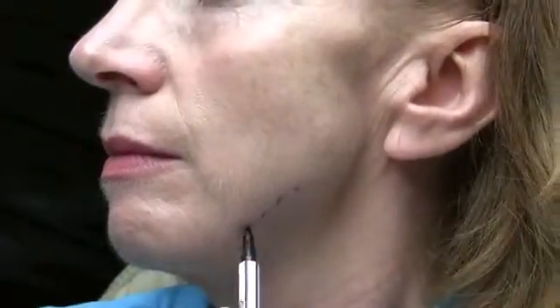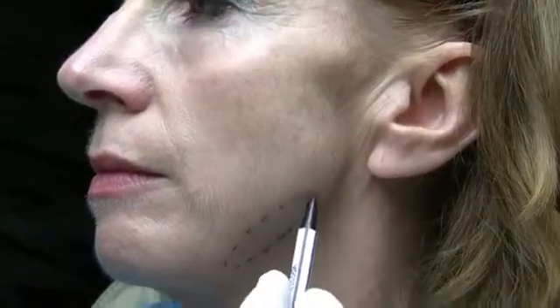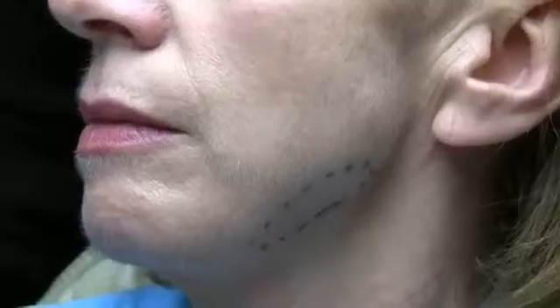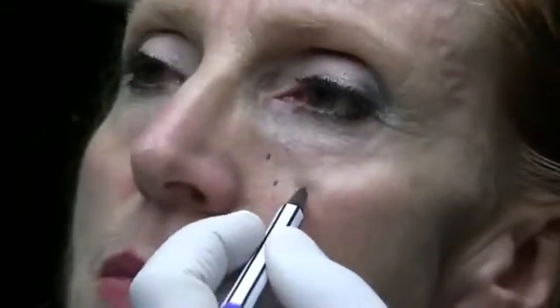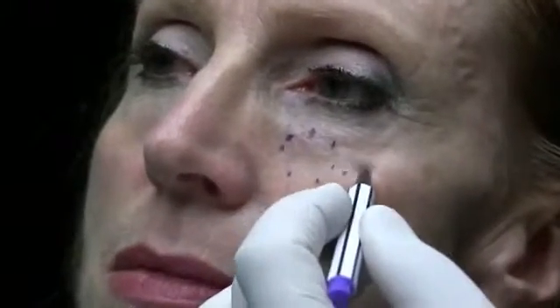Look at the areas that we're going to desire augmentation, and that's grossly our area there. Initially, this defect stands out with this extension being related to it.